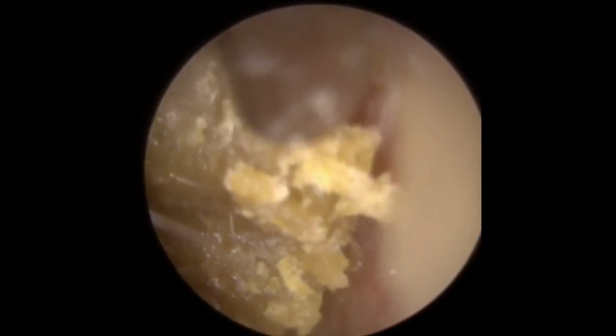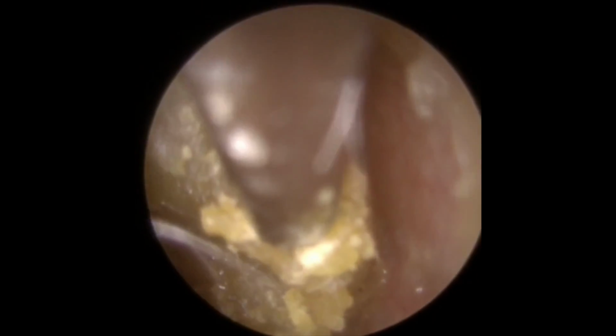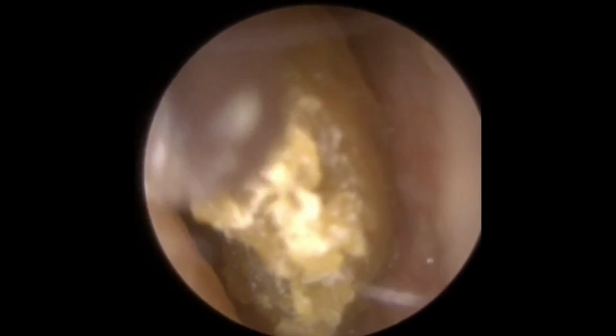Still turning it, still trying to maneuver it around. You can see it's just moving, it's wobbling back and forth. Started to move deeper into the canal now, so we've got to try and grab it again and bring it back towards the front. You can see that wider back end there.